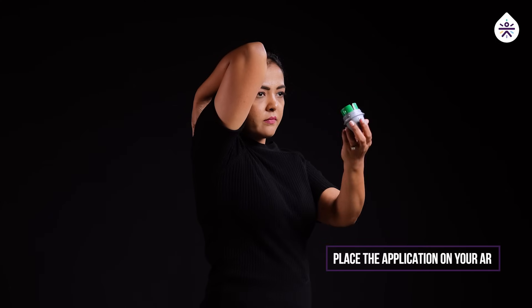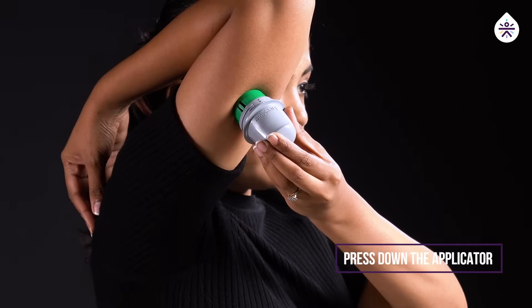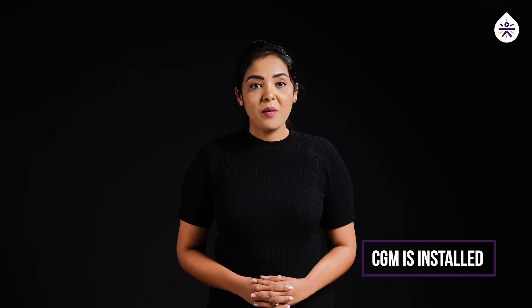Place the applicator on your arm like this. Press down the applicator firmly till the sensor is in place. Now your CGM is installed.